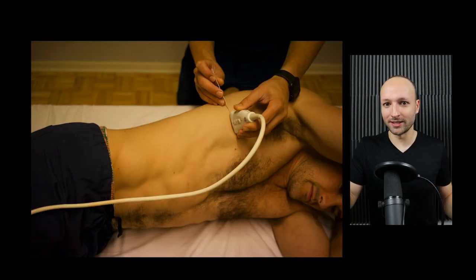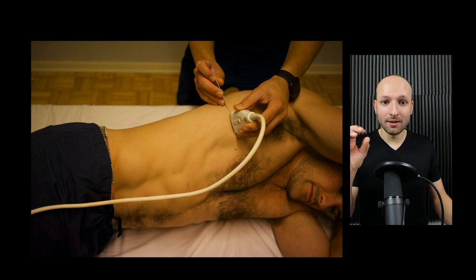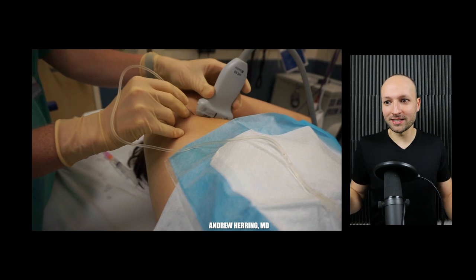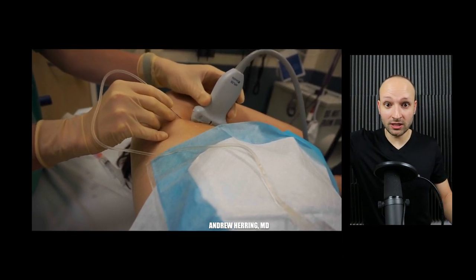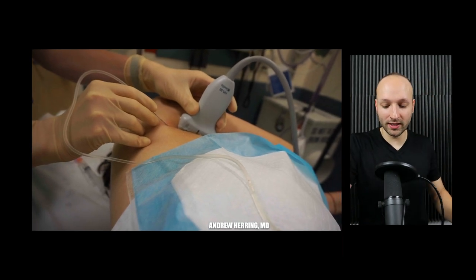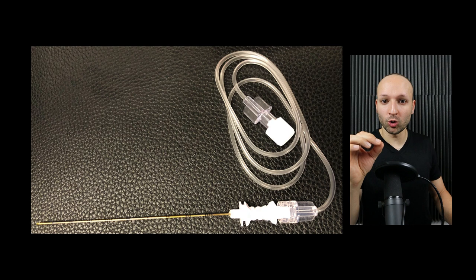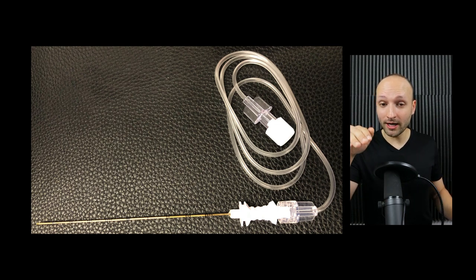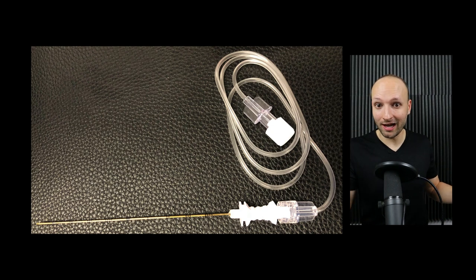Here is a demonstration courtesy of Andrew Herring performing the block in real time. The ultrasound machine is on the opposite side of the patient so you have a good line of vision to the screen. Use a nerve block needle for this because you want really good dexterity and control — the complication of this block is a pneumothorax. If you aim wrong and poke the lung, you'll collapse it. With good finite movement of the needle and good visualization, you're much less likely to lose control.